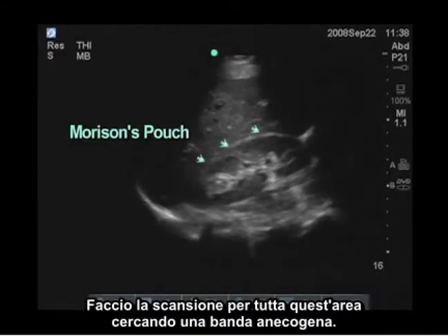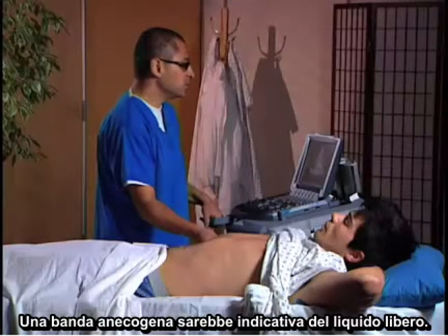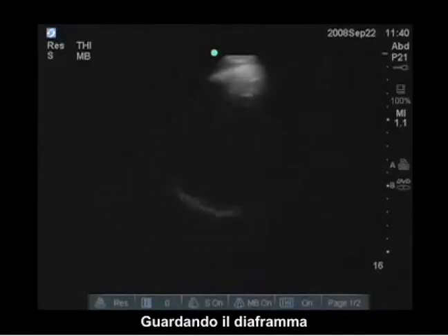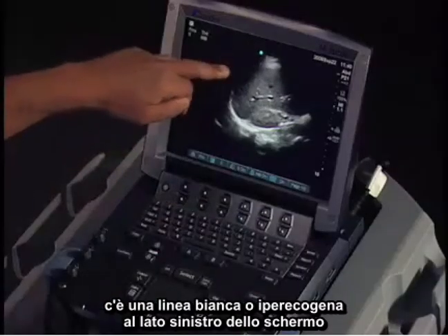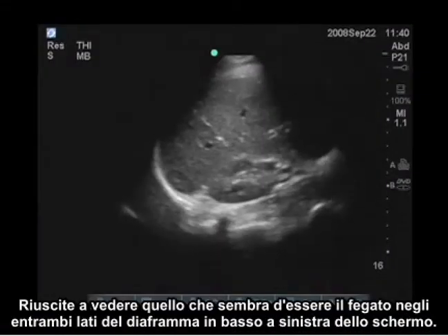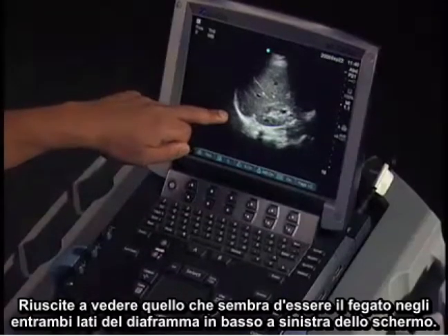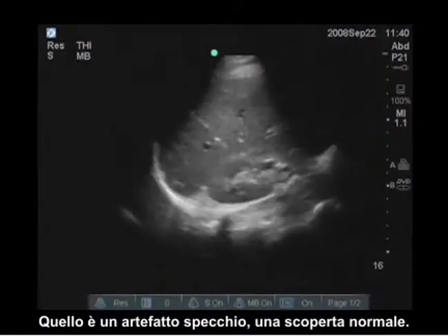We're scanning this whole area looking for an anechoic stripe, which would be indicative of free fluid. I'm also identifying the diaphragm — this is the hyperechoic or white line to the left side of the screen. You can see what appears to be liver on both sides of the diaphragm at the bottom far left of the screen; that is mirror artifact and is a normal finding.